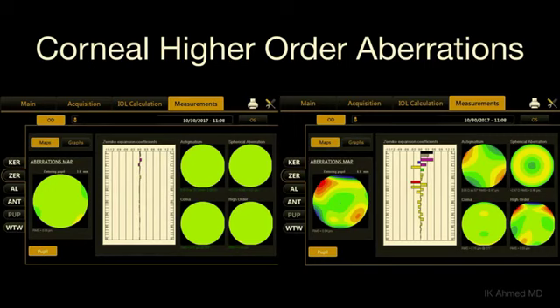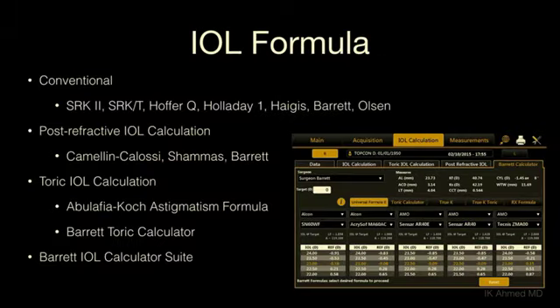As I said before, looking at this again from a multifocal perspective is important as well. Someone with a lot of vertical coma, you know, I would be suspicious and concerned about their visual quality. I counsel that patient, particularly for multifocal lenses.